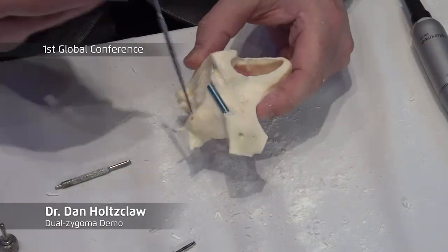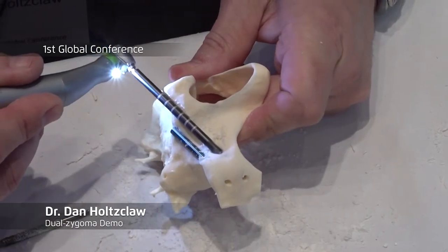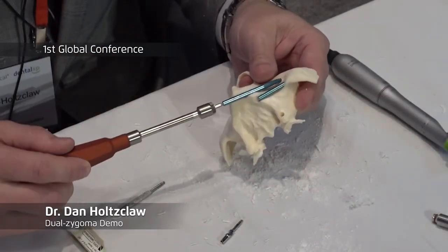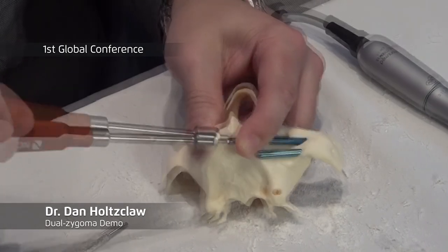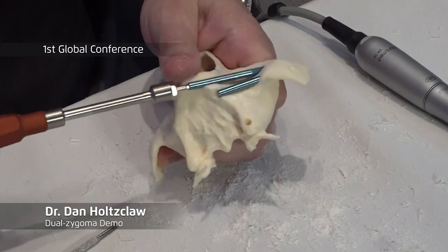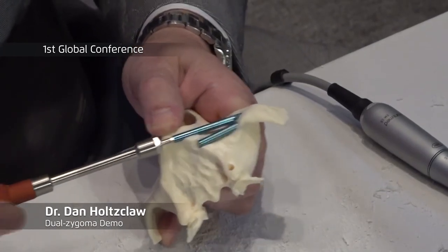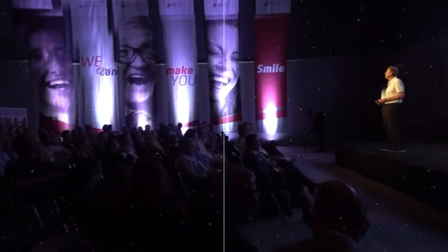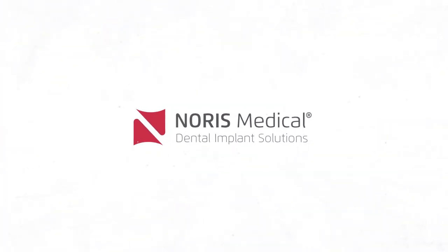I would also take my measuring device and feel — usually it'll be coming out lateral to the eye. For this one we'll go to drill number three, pop through, then go with a 52-5. Place this in, hold it against the channel, using your finger to make sure it's very tight. Then loosen, tighten, loosen, tighten — you can see the distance between the apices. I'm not crossing swords, not hitting each other — so that's good.